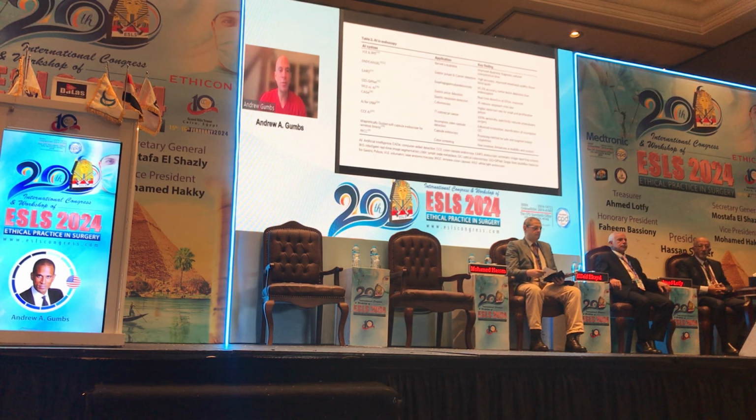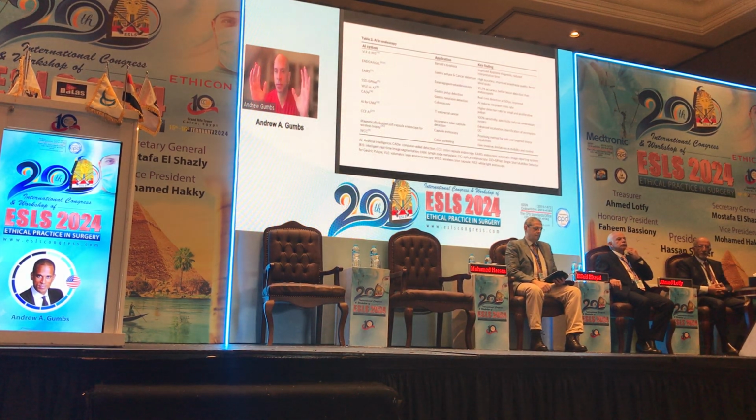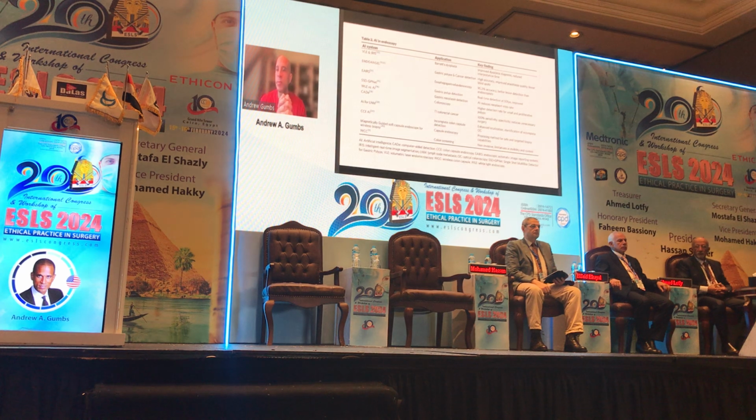This is the review article on AI and endoscopy. AI and endoscopy can be broken up into two things, really. The autonomous interpretation of the image. The detection of polyps is basically a simple way of understanding this. And there's many things on the market already that can do this, where the endoscopist does the colonoscopy, the image is recorded, and in real time, the AI can interpret what is being detected, what is being seen, the probability that things are cancers or what have you. So these are just multiple examples of that.